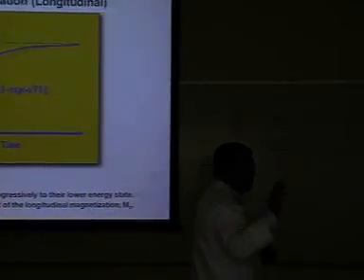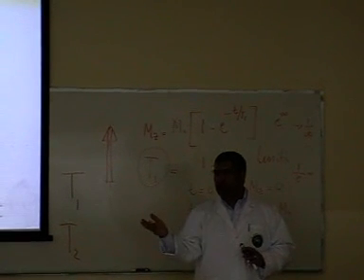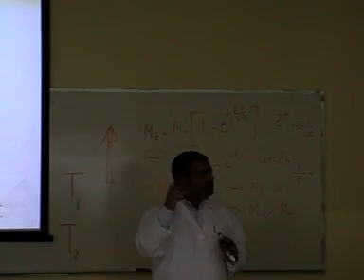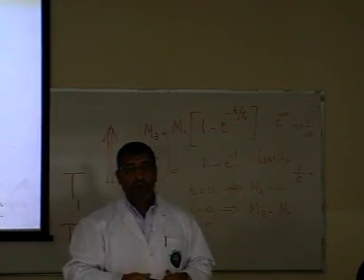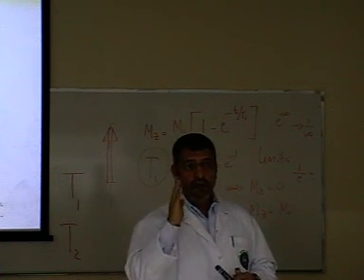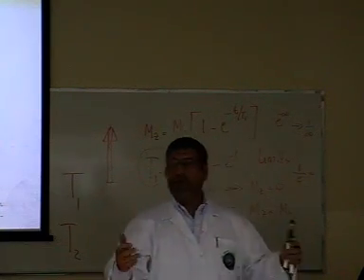Okay? So T1, again, because I'm sure you're going to be asked, and I'm sure you're going to be seeing this T1 throughout your MRI career. T1, T2. So what's the definition again of T1? It's the time needed for the longitudinal magnetization to reach the signal of 63% of the initial. Thank you very much. Excellent.